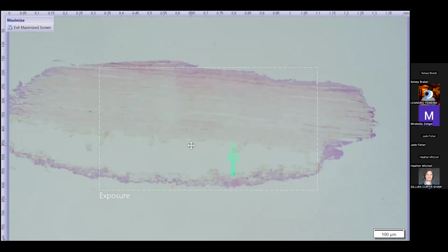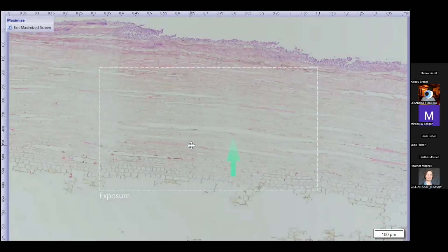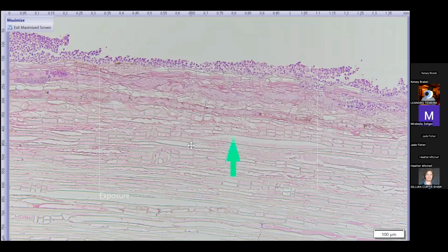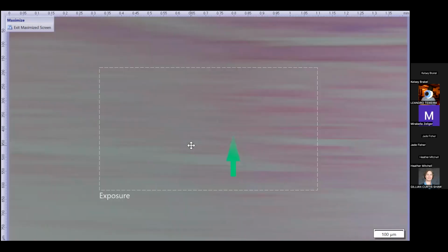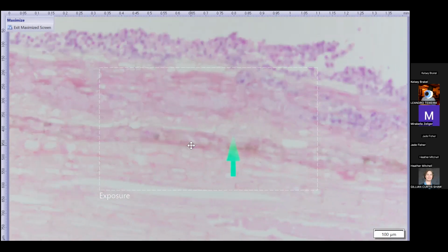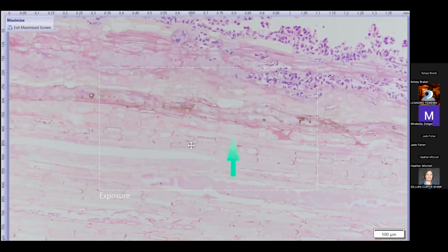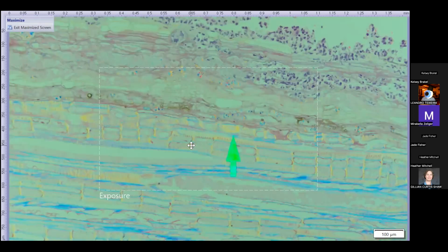All right, and then here is our section of our foreign body. Looks pretty consistent with plant material. It's surrounded by macrophages and neutrophils. And then it's accompanied by lots of bacteria and pigmented fungal hyphae. So, nice contamination here. Let me see if I can polarize this.